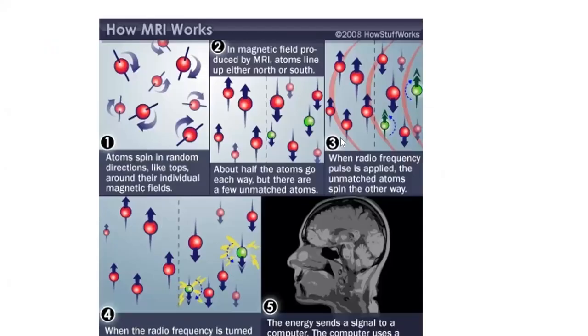Now, the thing I lost here in translation with bringing this other talk up is I actually want to show you guys some examples of some x-rays that we can try to describe, and learn how to describe what fractures look like. How does that sound? Good? All right. So I'm going to use good old-fashioned Dr. Google. Questions about the material we covered already?